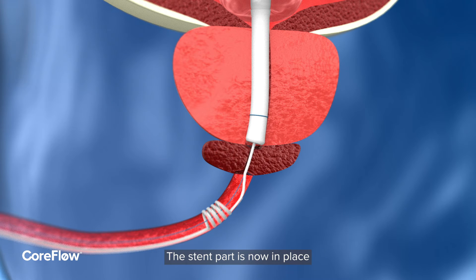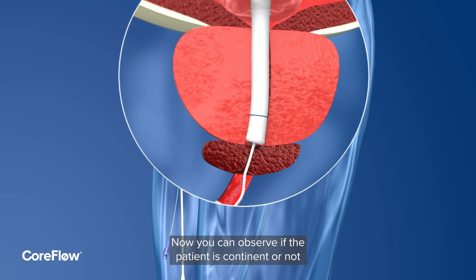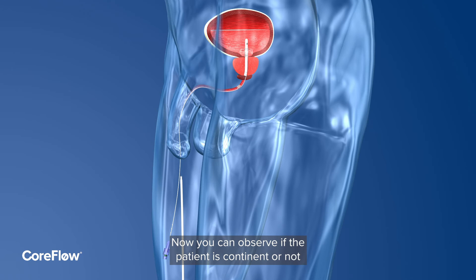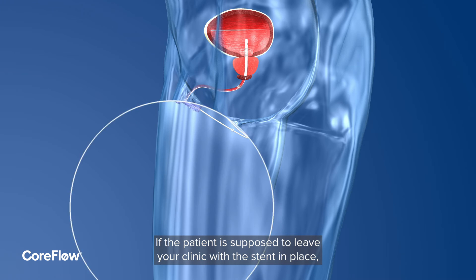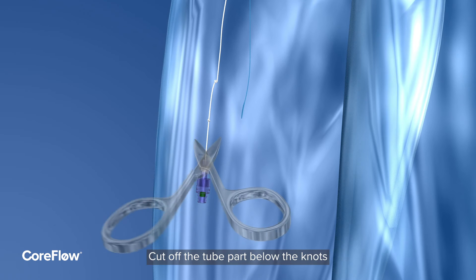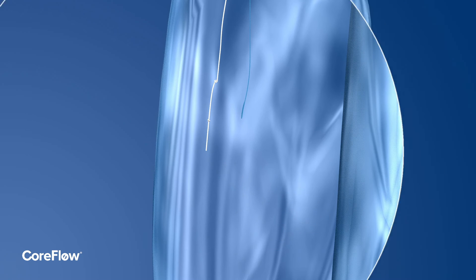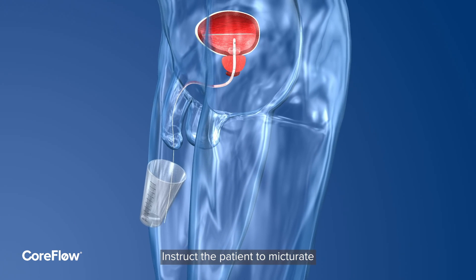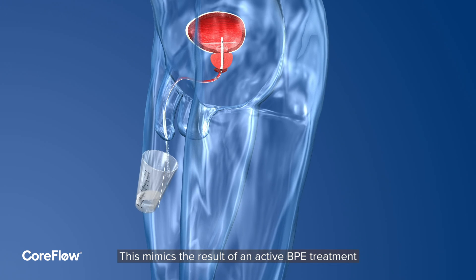The stent part is now in place and is temporarily resolving the obstruction of the prostatic urethra. Now you can observe if the patient is continent or not. If the patient is to leave your clinic with the stent in place, place two overhand knots on the part of the balloon inflation tube close to the inflation valve, then cut off the tube part below the knots. Instruct the patient to micturate — this mimics the result of an active BPE treatment.